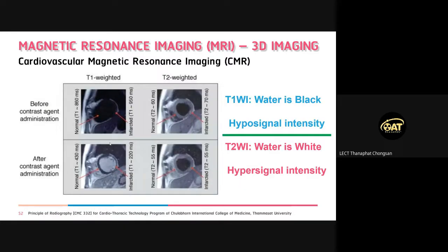Okay. There are example images about MRI scan mode. In radiology, we will use two modes to scan: T1 weighted and T2 weighted. Easy to clarify that. In the picture, the upper part does not use contrast media and the lower part uses contrast media. Easy to clarify.